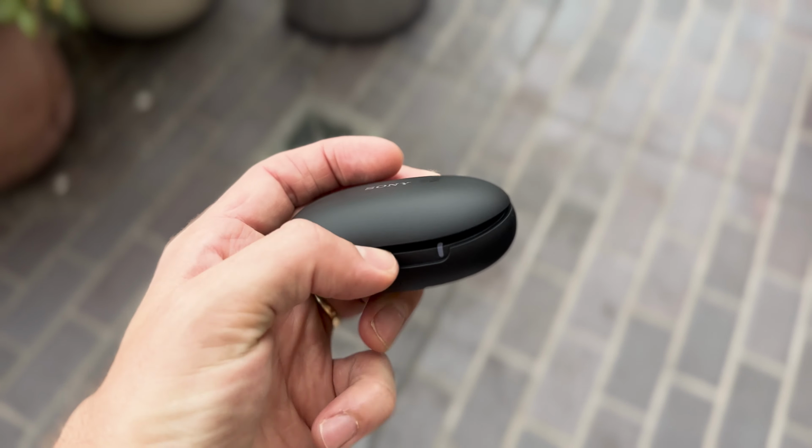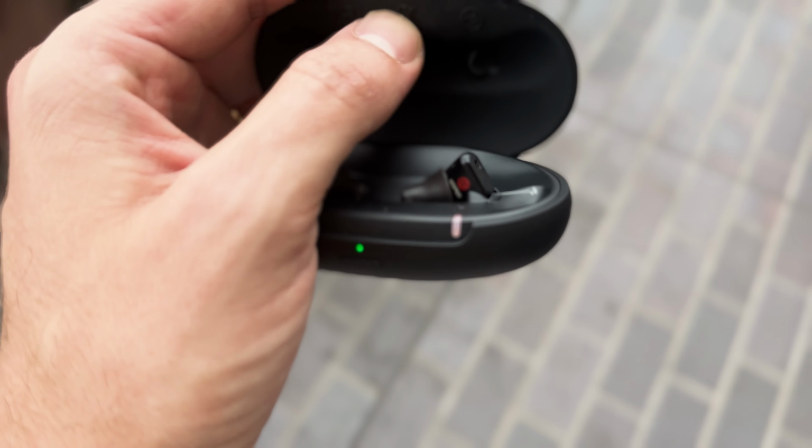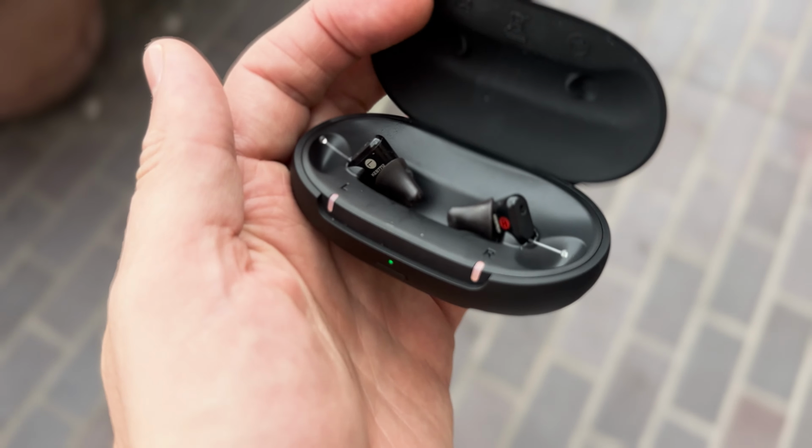And we really find the same story when it comes to battery life. Sony CRE-C20 has a 28-hour battery life. That means if you charge up your devices, you pull them out, put them in your ears, they will not die for 28 hours. Of course, compare that to Apple AirPods and it's 4 to 6 hours. The two are clearly designed for different purposes. One for all-day hearing aid wear and the other for situational wear and great music streaming.